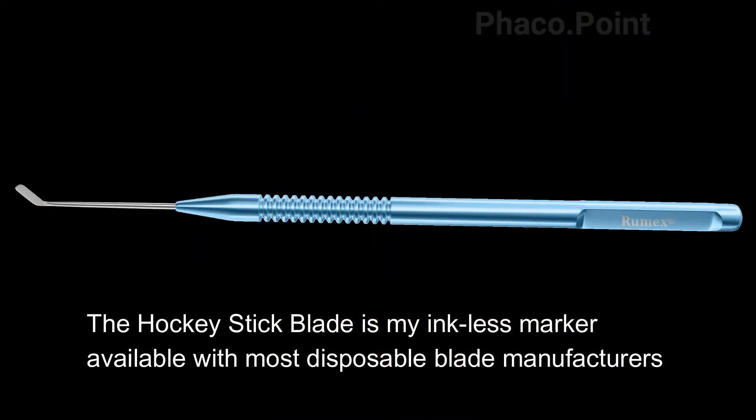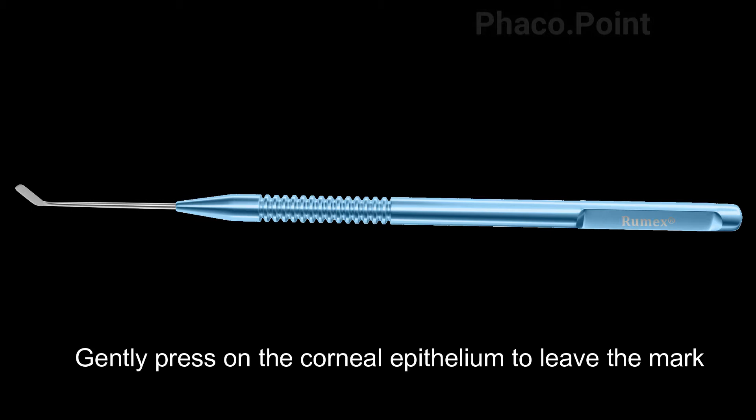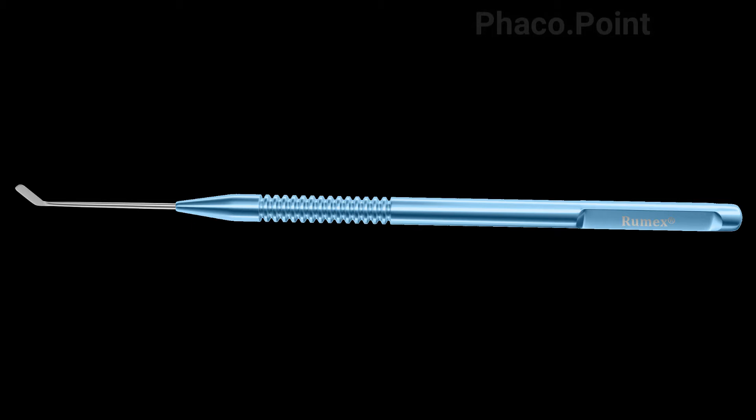This is my new inkless marking instrument — the hockey stick blade, which is a disposable unit manufactured by most companies that manufacture disposable blades. All you have to do is align the sharp edge of the hockey stick blade on the corneal epithelium and gently press to leave behind a mark.